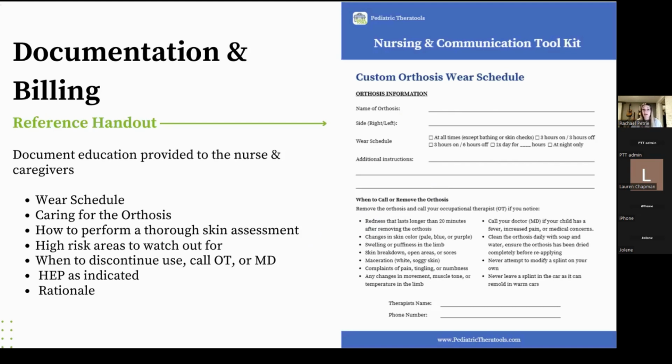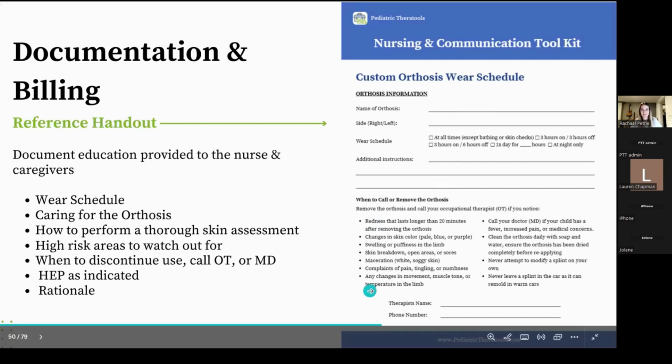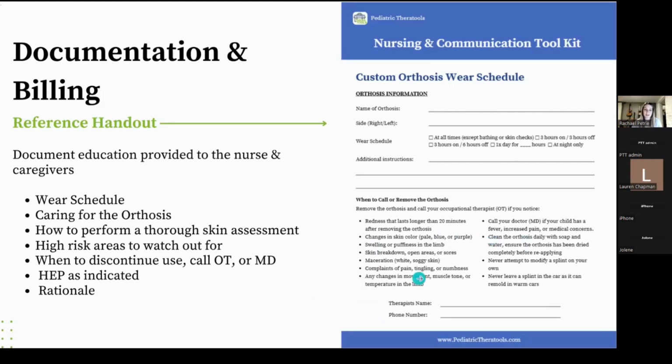That way I can document it and I can see and give cues as I need to help them. Same with the nurses. And really they appreciate that because we're only here for a brief period and then they're the ones having to do it. So they're really thankful when you take extra time to make sure that they can get the splint on and off. So if you can, and if it's indicated, do some exercises with the splint on.